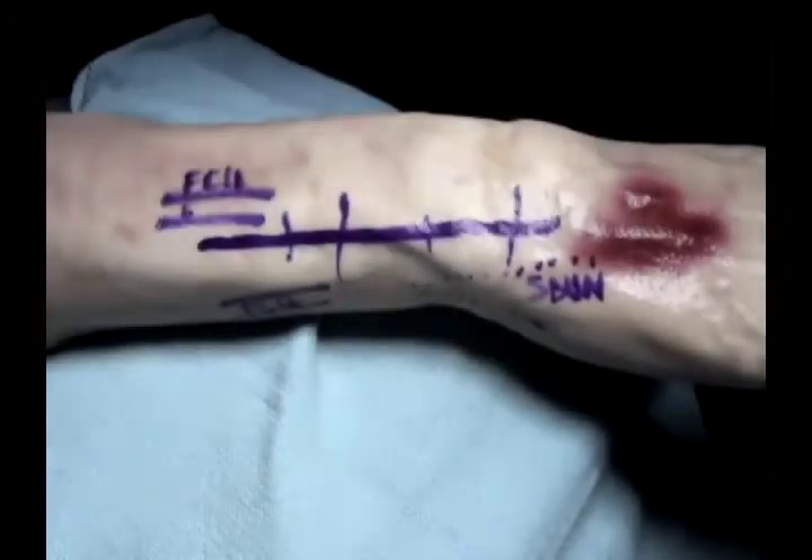Distal Ulna Arthroplasty for replacement of the arthritic distal ulna. This is a valuable technique that provides excellent pain relief for patients with either traumatic or degenerative arthritis involving the distal ulna.